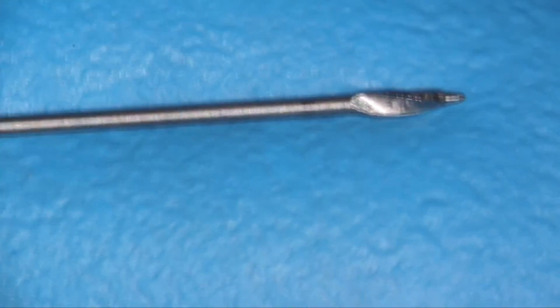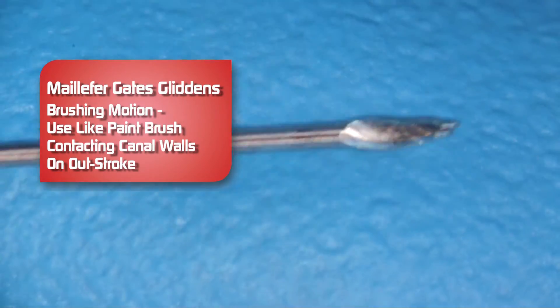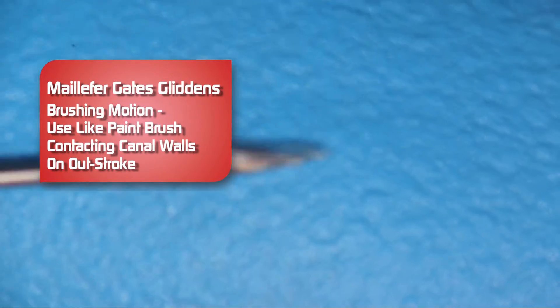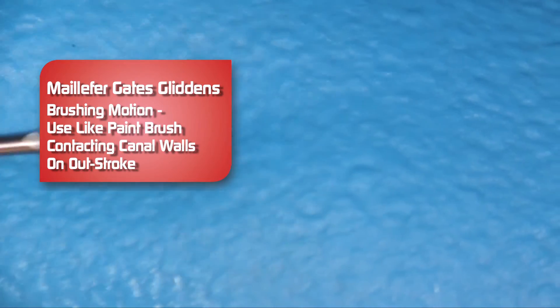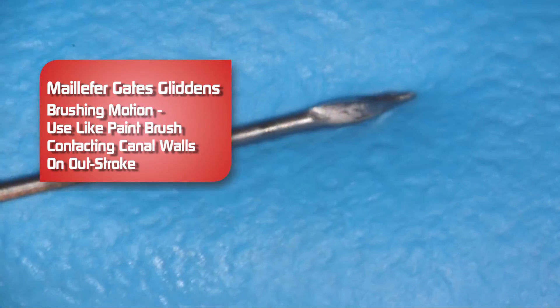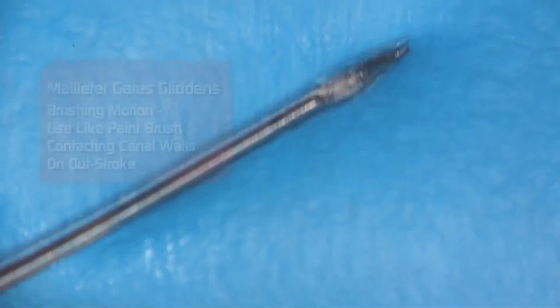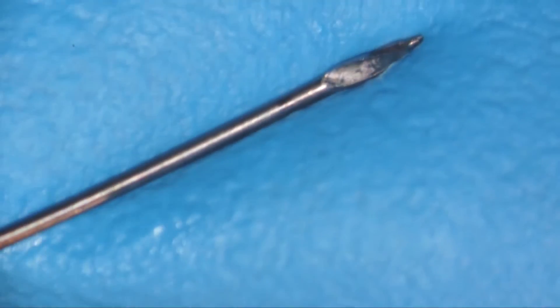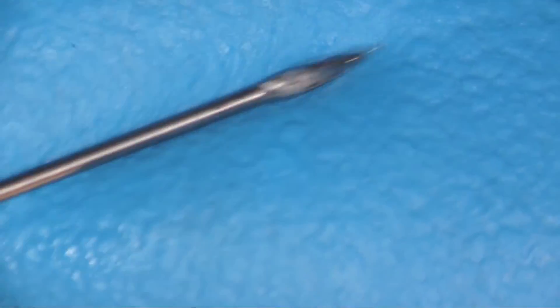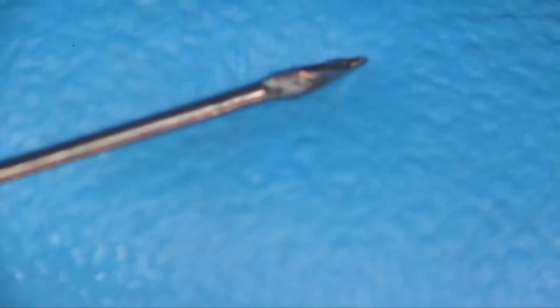When we use a Gates Glidden burr — and this happens to be a number two — we use it like a paintbrush, just a very gentle motion here to clean off the sides. The Gates Gliddens are pretty flexible. As you get up in size, they get a little bit stiffer, and as we go up in size, we want to move more coronally in the canal. It's a nice way to clean out the coronal portion of the canal, and you never want to force it. Again, it's just like a paintbrush — very gentle. And the smaller sizes have more flexibility.